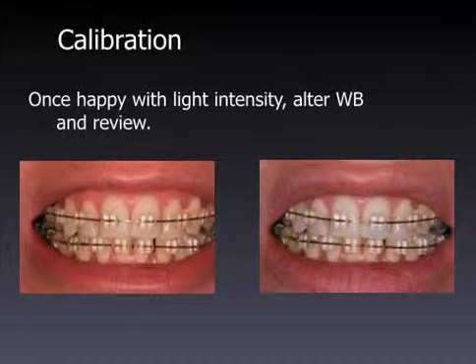The latest cameras, though, have very good ETTL. ETTL is electronic through the lens metering. Before, your teeth reflect a lot of light and used to confuse the camera. It's too much light entering it. These days, with the better electronics, it's much better. So you could probably just set your camera to f22, 1/250th for the shutter, and take the pictures, and the camera will calculate how much light you need and the flash output itself.